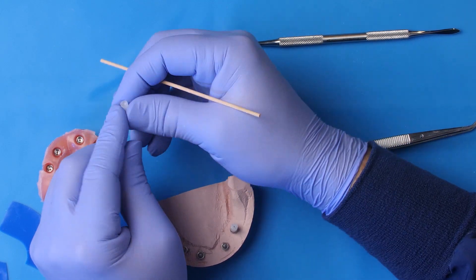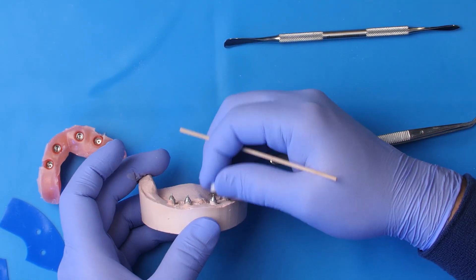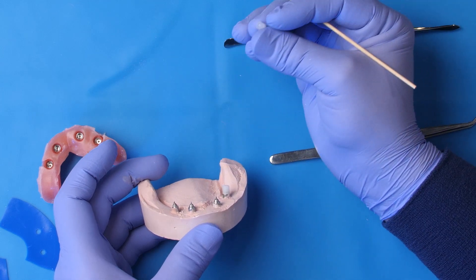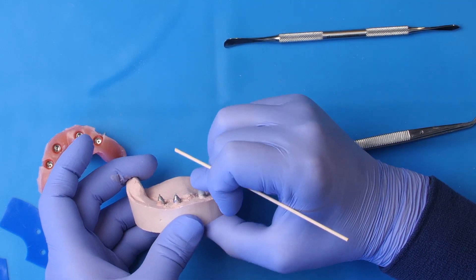Obviously, you cannot press the press-on cap in upside down — it won't work. It has to be the mating surface of the press-on cap to the multi-unit abutment, and you just press it down.